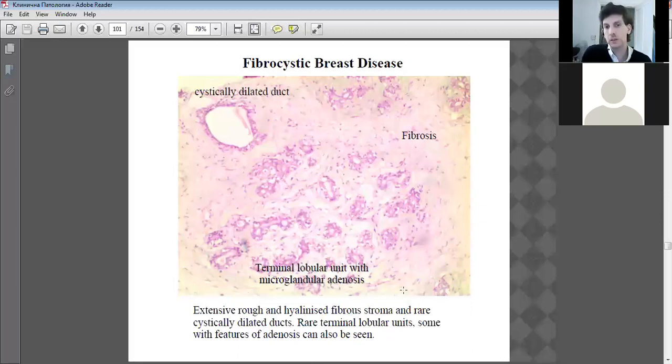That's kind of like a supportive cell, trying to support the isolated cells, if you like, but it's a bit abnormal because they're not normally that size. They're normally much smaller. These have grown in size. So the adenosis is quite evident.